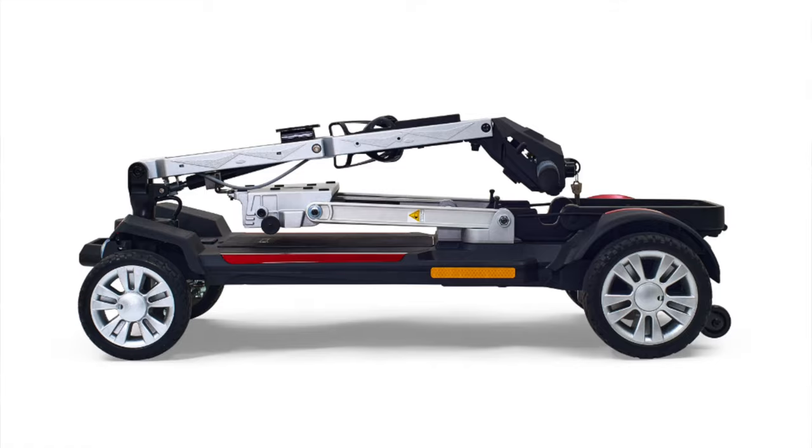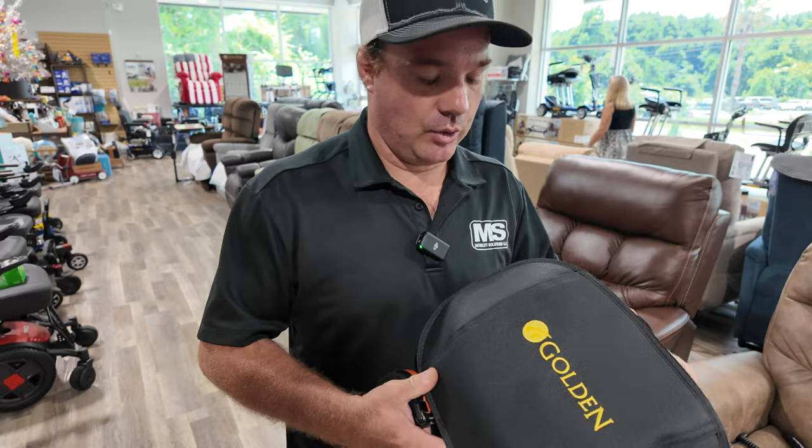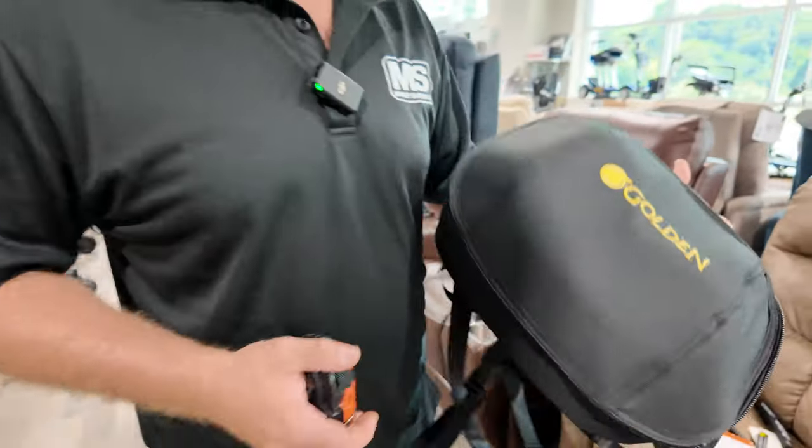I have a bag, and we give these away when you buy the GB120 Fold-Up Scooter as a gift to you. This is a really cool little bag, and I'm going to show you how it works.